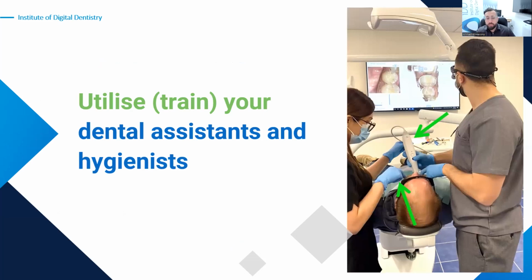You can also utilize your dental assistant to help you during scanning. You'll notice in this picture on the right, my DA is retracting and she's holding the cord. That just makes the scanner feel weightless. It's these little things that can make you faster and better at scanning. And I've stressed it a lot in previous webinars. Soft tissue retraction is critical when you're scanning.